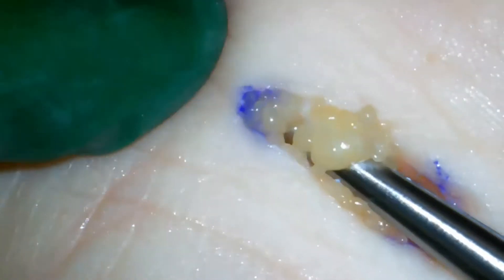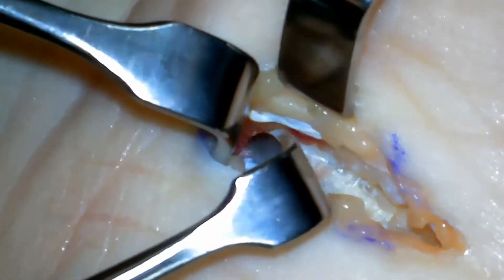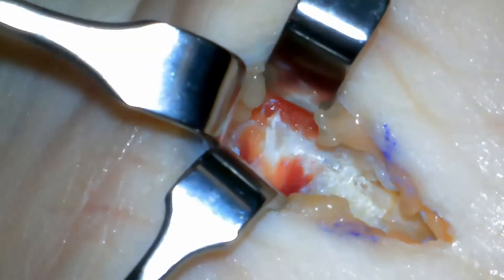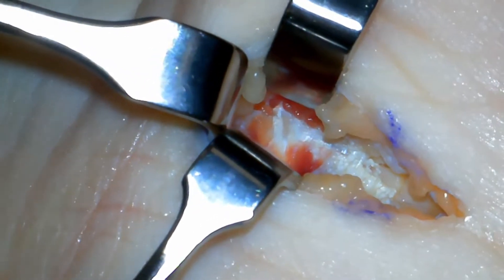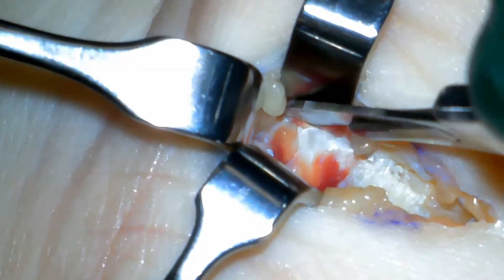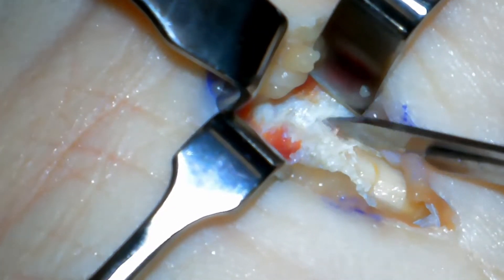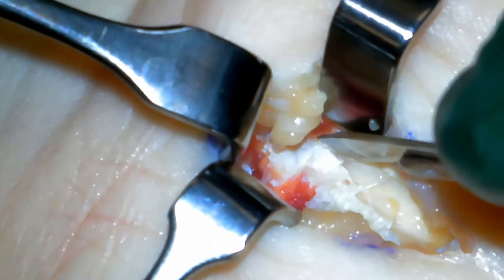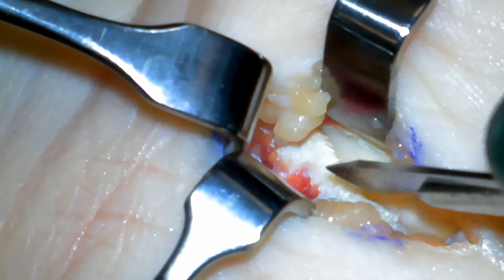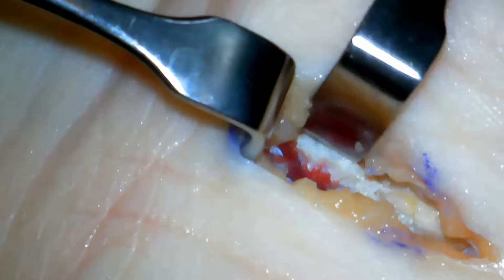Here a pocket is created underneath the skin which will be used later in order to divide some of the last remaining tissue. The leading edge has been nicked and now with the scalpel we are going to continue to cut that transverse carpal ligament, which is the main ligament that causes carpal tunnel syndrome.